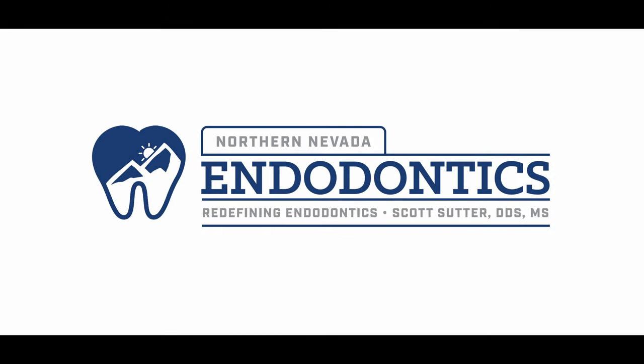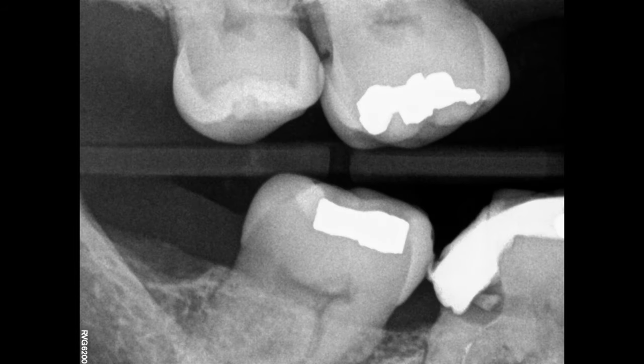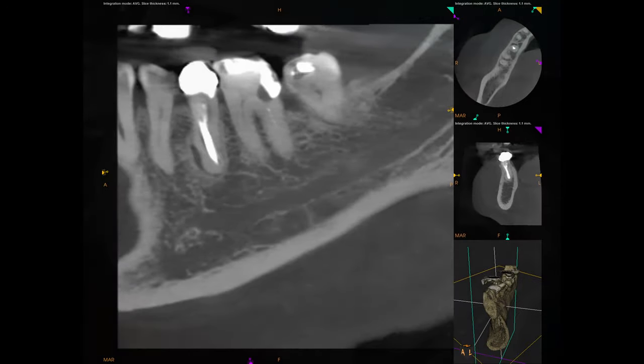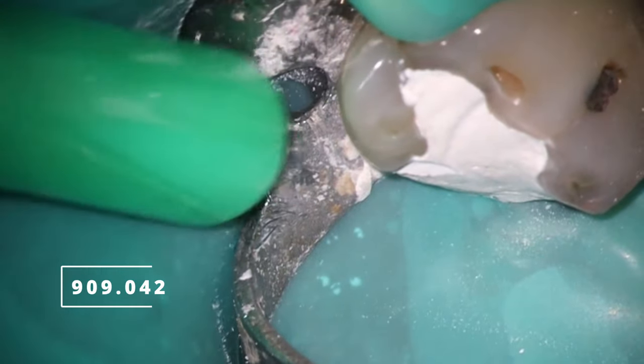Hello everyone and welcome back. We have a fun one for you today. This case was sent over by a great dentist who had actually started the root canal. There's really deep caries on this one. You can see there's a little bit of material in the distal — I'm pretty sure it's just calcium hydroxide and IRM on top of the tooth. There is a little finding on 29, asymptomatic at this point, so we'll just continue to monitor it. IRM is my favorite nemesis in the world, so we're going to show you how we take care of this tooth.